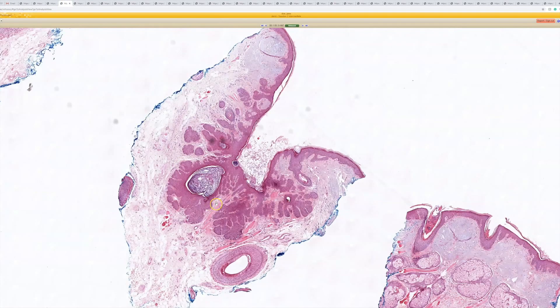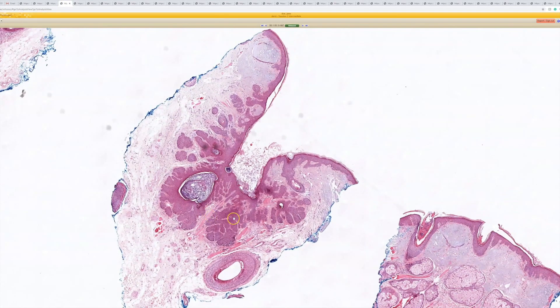Case number three. This is a nice one. There's a follicularly based invagination of the epidermis filled with keratin debris, and it looks like just a widened follicle associated with a little keratin cyst, with wide finger-like projections coming off of the epidermis. Even from low power it looks like a big dilated pore of Winer, but I'm favoring a pilar sheath acanthoma based on those thickened rete ridges.